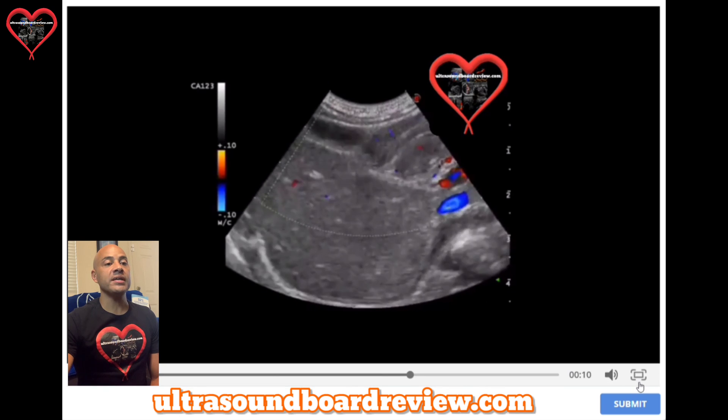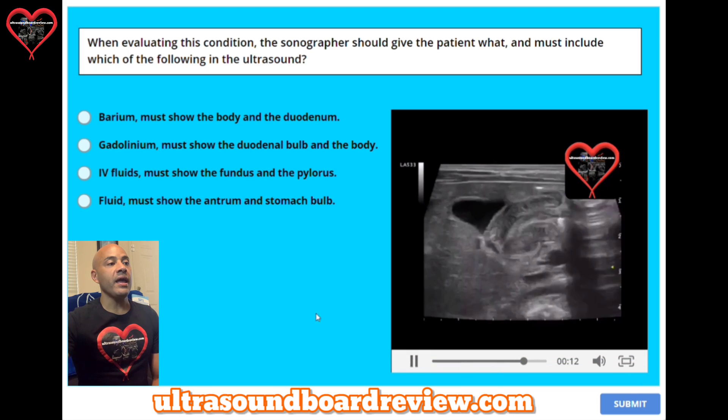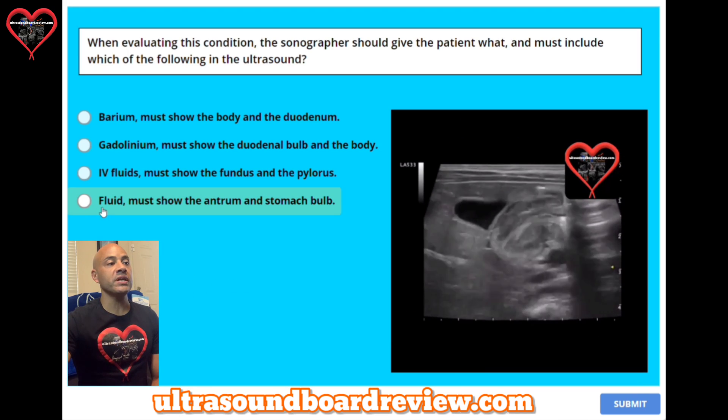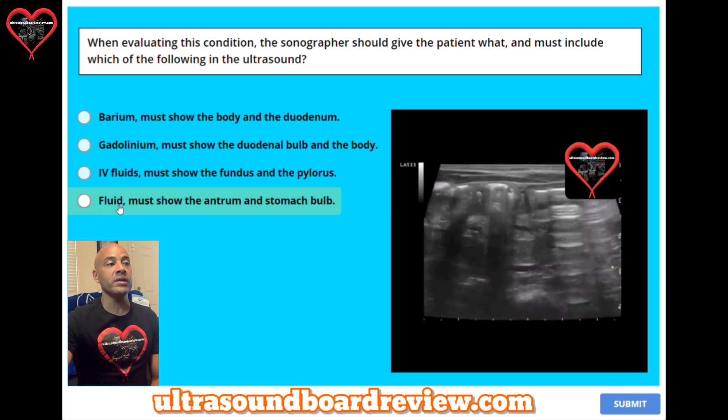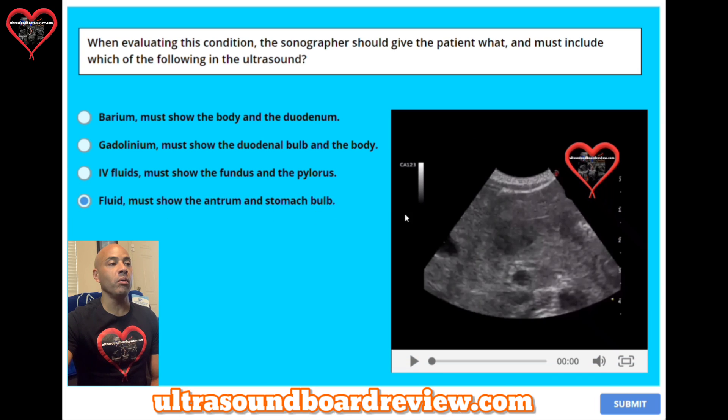This patient has pyloric stenosis, and it's important to give the patient fluid. You must show the antrum and the stomach bulb.